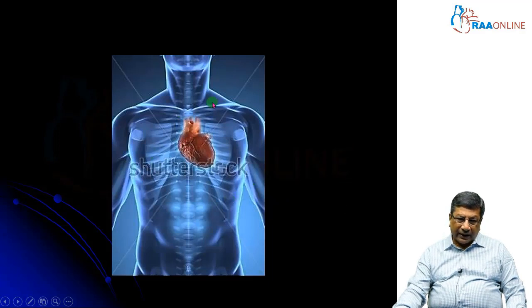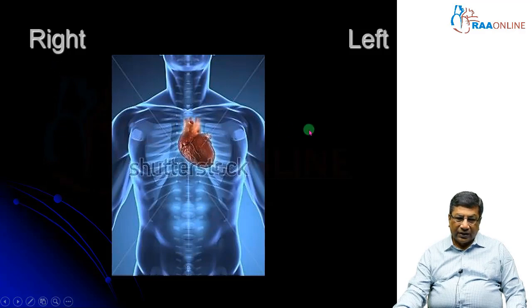For my entire lecture of this course, whatever you see on this side of the slide is left and whatever you see on this side of the slide is right. So it is not your right and left. It is as if you are sitting and seeing the patient who is standing in front of you. So this side of the slide is left and this side of the slide is right. For my entire course, you must remember this is the left side and this is the right side.